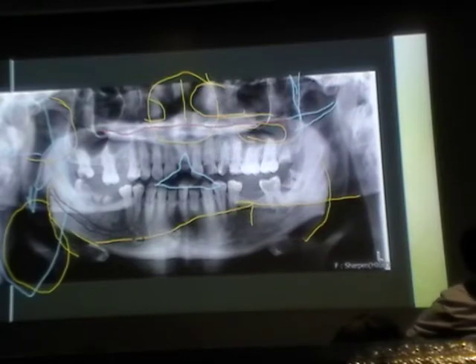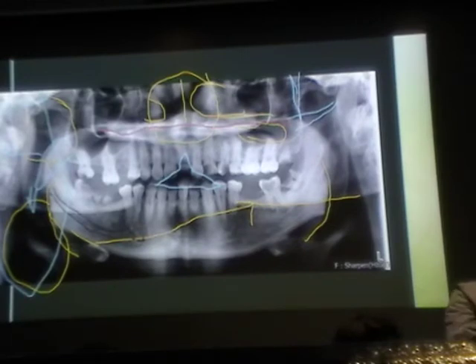How are we supposed to differentiate that? Let me ask you this question. If X-rays are going to pass through the air, how does that look? Dark, right? Soft palate has got some soft tissue, right? So you can differentiate soft palate from the airspace.